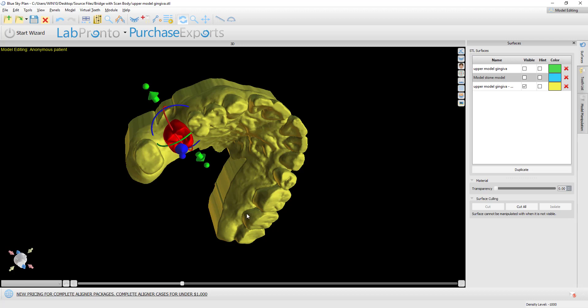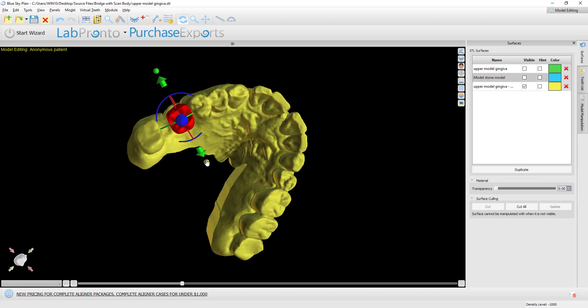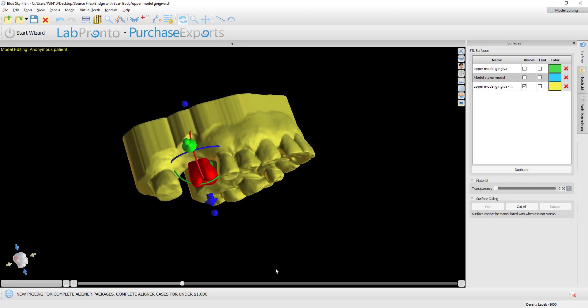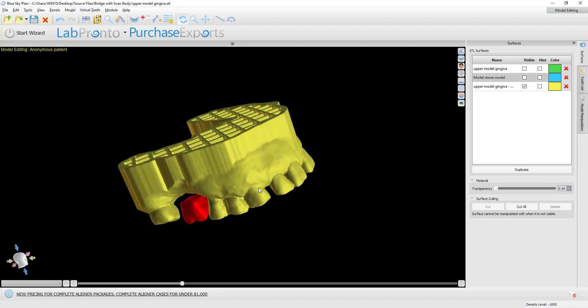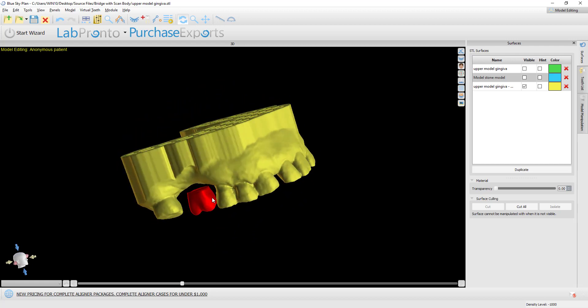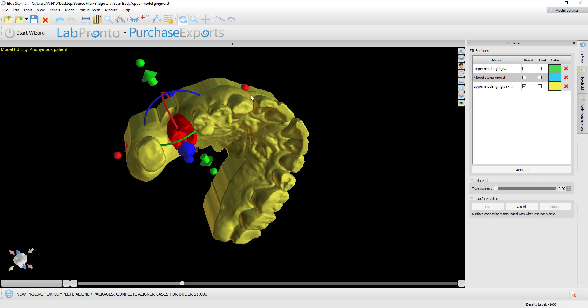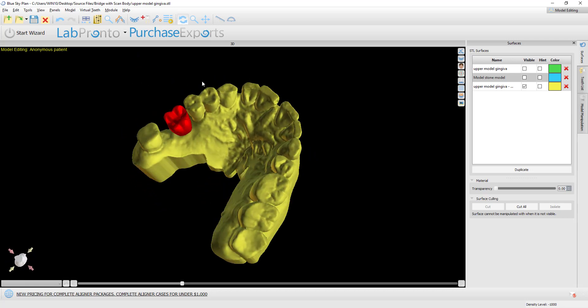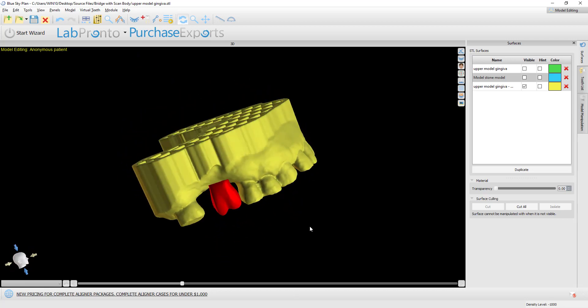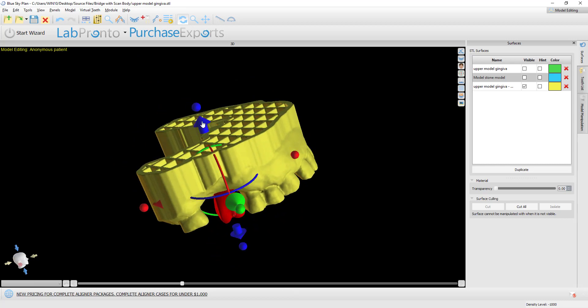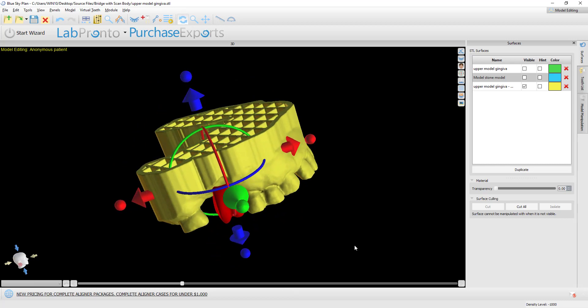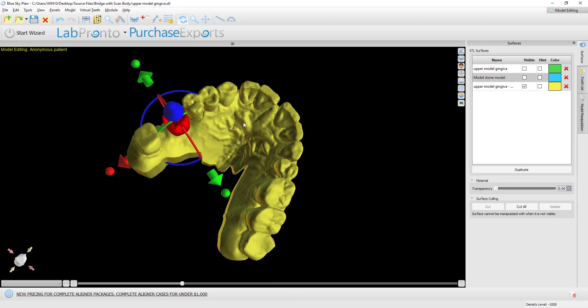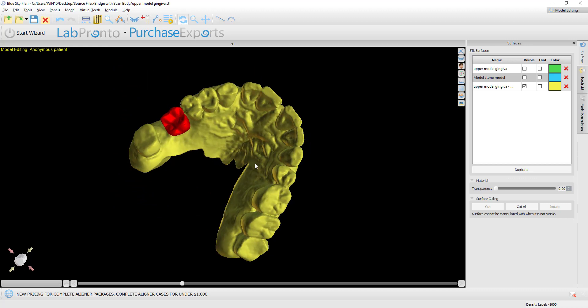For our purposes now, I want to make sure that the tooth is connected to that model so that it's exported as one model. We want to make sure that there's an overlap there. We can just extend it down into the model to make sure that we have a solid overlap.